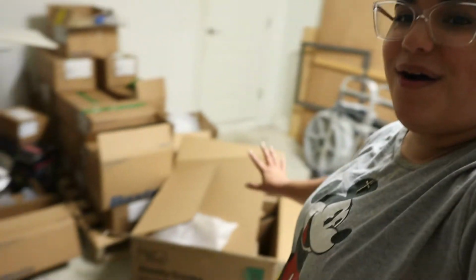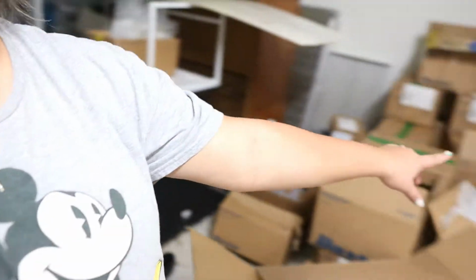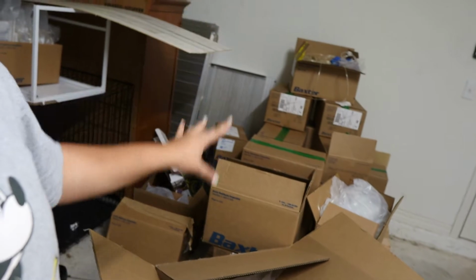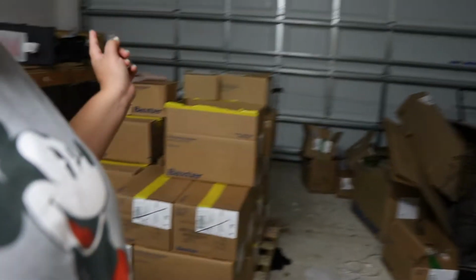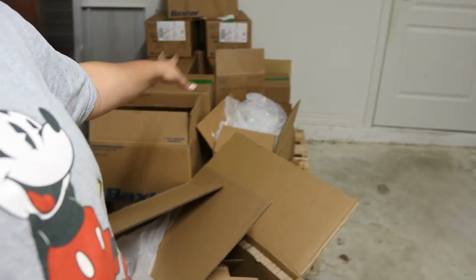By the way, welcome to our garage. This is all dialysis supplies. I know it's an absolute mess. I'm just going to show you the mess, and it is what it is because it is taking over this garage. We actually just got done throwing away a bunch of boxes, but you see how these are green and these are yellow? That's different prescriptions of dialysis. So that's a stronger solution and that is a weaker solution. Daniel is now on the weaker solution, and this is a stronger solution. So now we have tons of it.